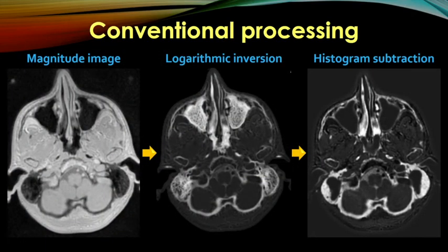Now, another comment I get is about accessibility. So people will say to me, maybe this works, but still, CT is easy, it's cheap, I know how to read it. Why do I need to learn how to read something new? And so we're working very hard on generating synthetic CT images, which people will be comfortable with, both radiologists and surgeons, in their daily work.